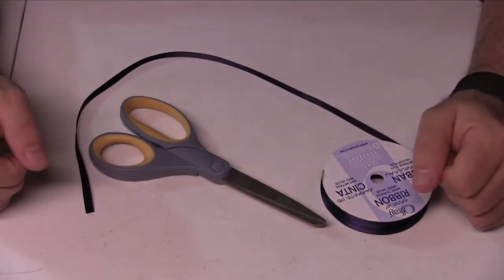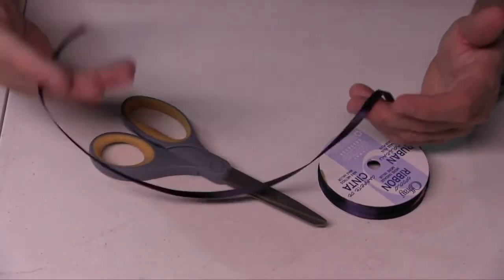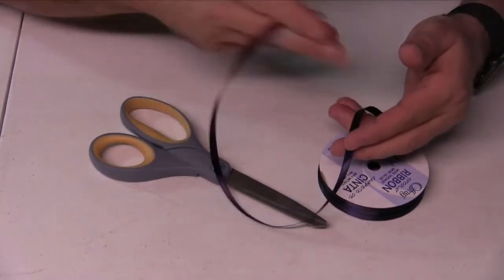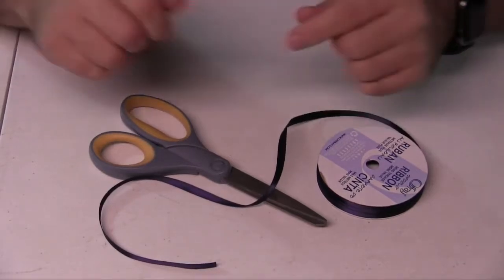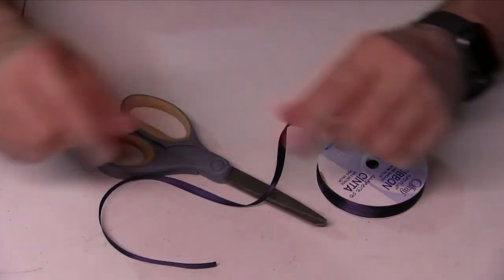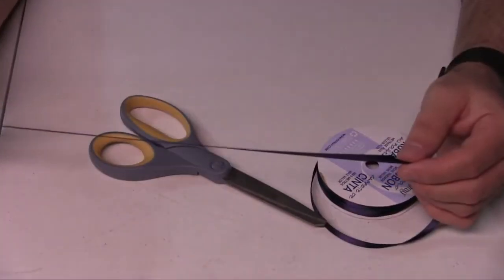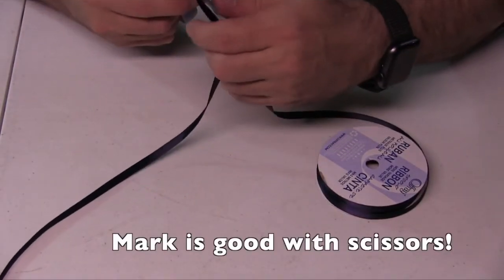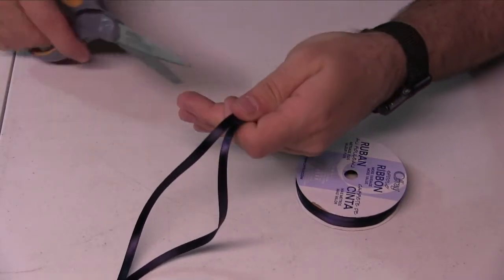Okay, for this next part of the construction process, what we want to do is create two lengths of ribbon. People have been using all kinds of things, sometimes elastics that they can just attach to both ends, but I'm going to show this particular way of using two of these pieces. People have also been using the kind of stretchy tape that we use to mark trails, like that orange tape, and tying it to the back of their heads. So I'm going to cut two fairly decent lengths of this particular ribbon. Give myself ample space. Make sure they're approximately the same length by doubling them over.